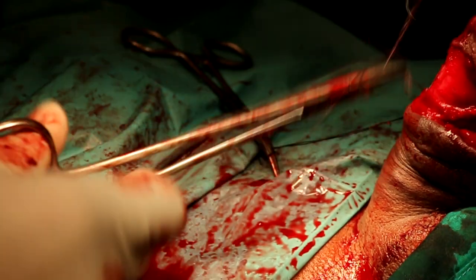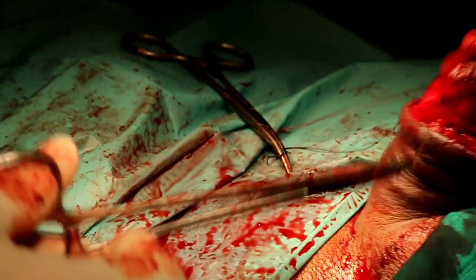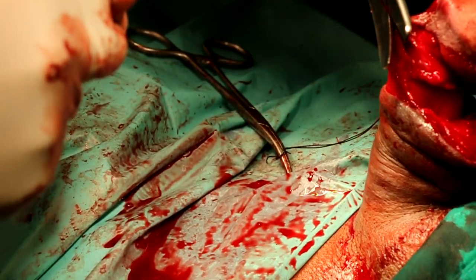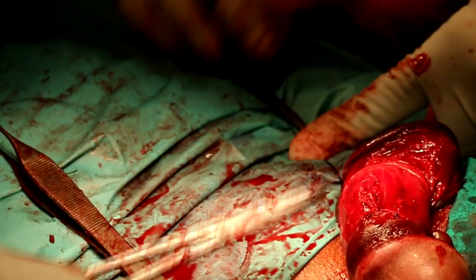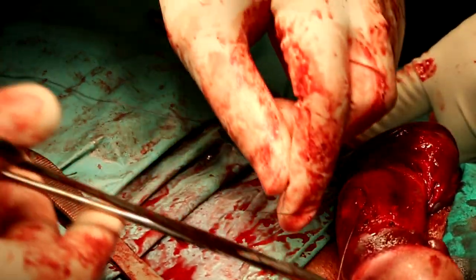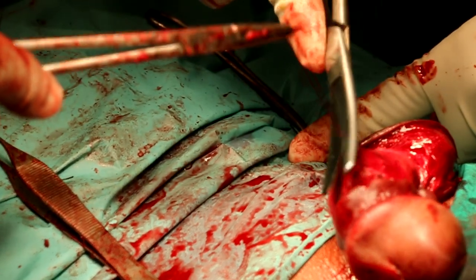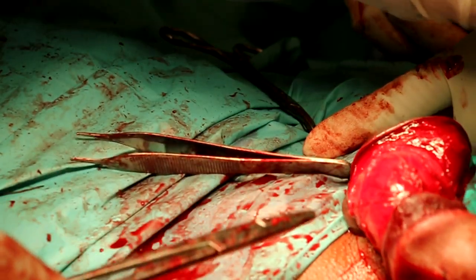All the sutures should be absorbable. In this patient I used absorbable sutures, even for the skin. You see now, I'm almost done. The fascia is completely covered, there is no bleeding now, and I did some compression, which I will show you later. The penis is almost returned to its normal anatomy.